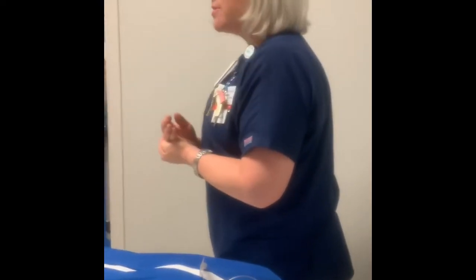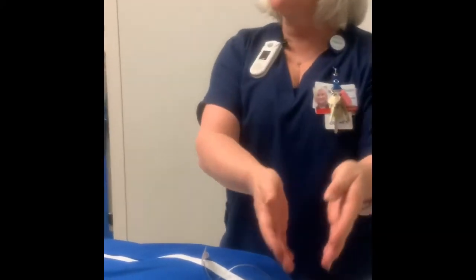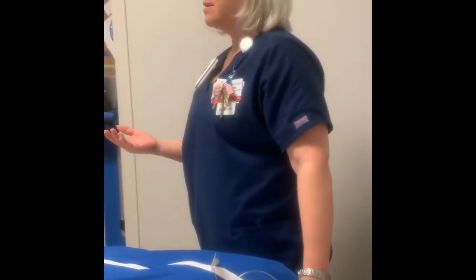Okay, so any questions about trachs? I'm gonna have you go through this again. I'm gonna give you a case. You're gonna take care of this for me, okay? So now we have a laryngectomy as your other altered airway that we do here, but they may come in with a trach because it's a pretty fresh laryngectomy, okay?